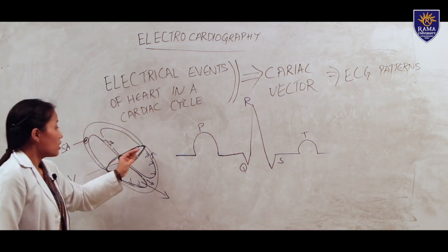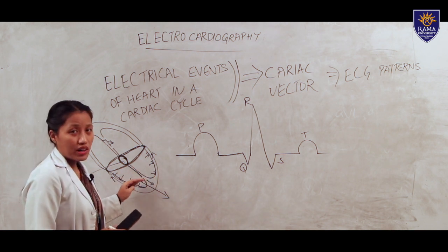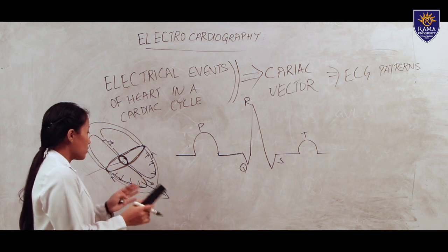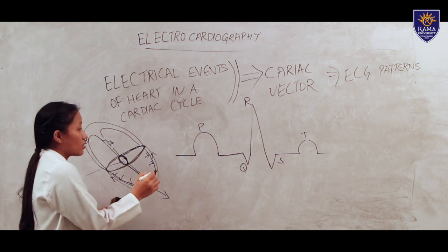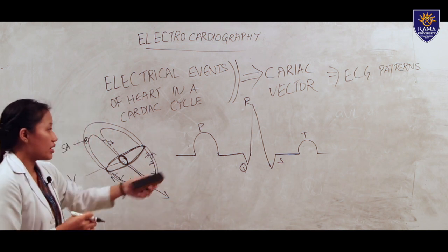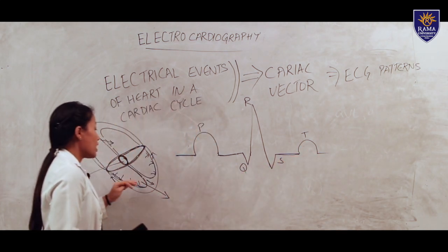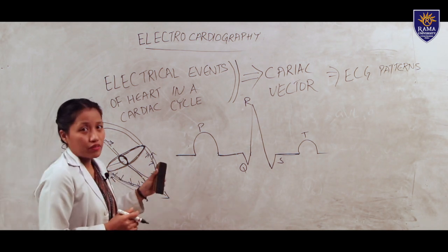After completion of the ventricular depolarization, ventricular repolarization will start. Before the ventricular repolarization starts, and before completion of the depolarization, current will not pass. That forms the ST segment, which is an isoelectric line. After that, the ventricular repolarization forms the T wave. This is known as ventricular repolarization. It moves upward and rightward with a moderate velocity.